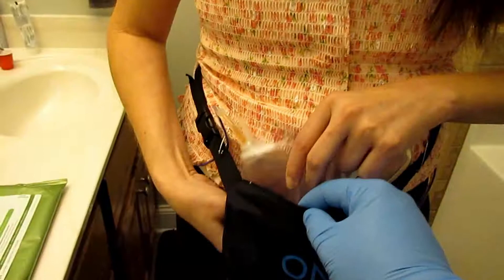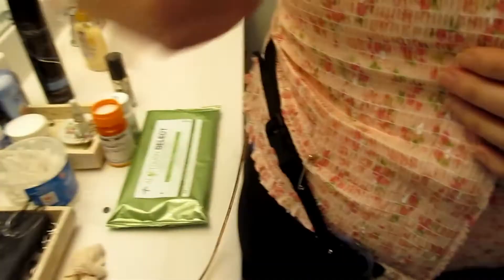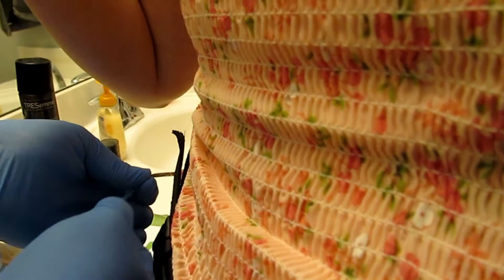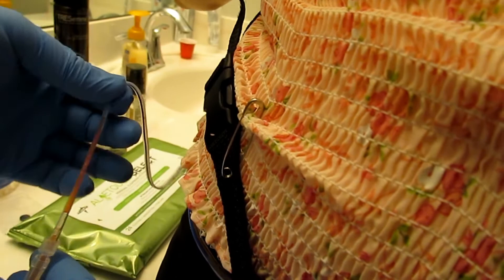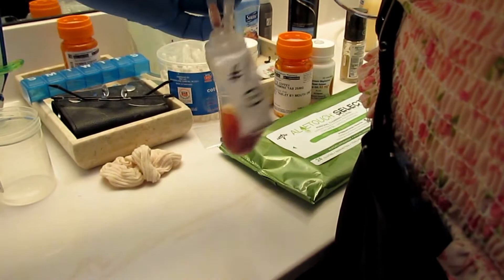What you have to do is take these tubes and strip them. You've got to hold on to them pretty tight because you don't want to pull them out, so hold tight and then squeeze it real tight and just strip it out. This tubing can stretch several times longer than its normal size, so it's not going to hurt it. Whether you're doing this yourself or having somebody else do it, you're going to get some clumps — you strip it out like so. Sometimes the blood will clot in the tube or in the bulb.